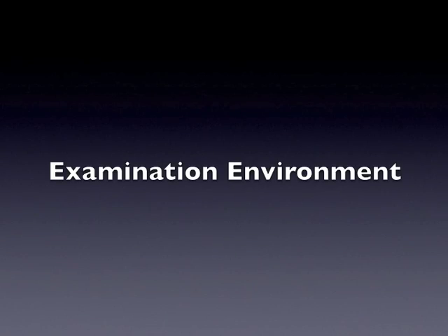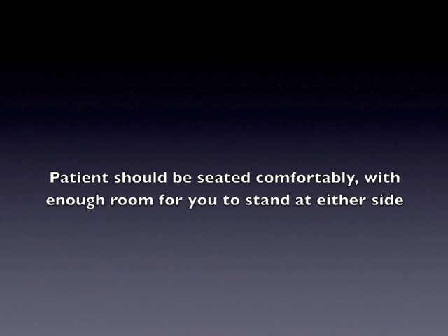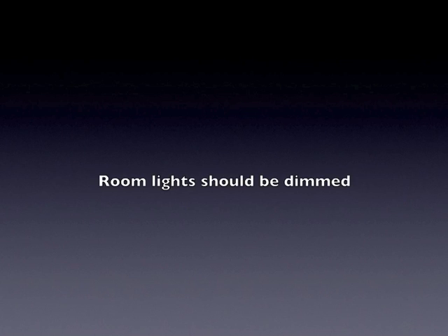Before examining the eye, it is important to set up the environment to allow a satisfactory examination. Firstly, the patient should be seated comfortably with enough room for you to stand to either side. Room lights should ideally be dimmed, although this has not been done for the purposes of this video.